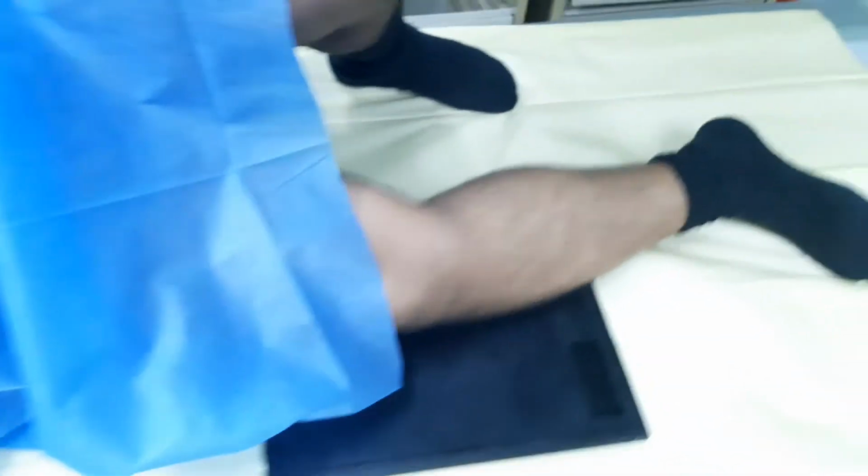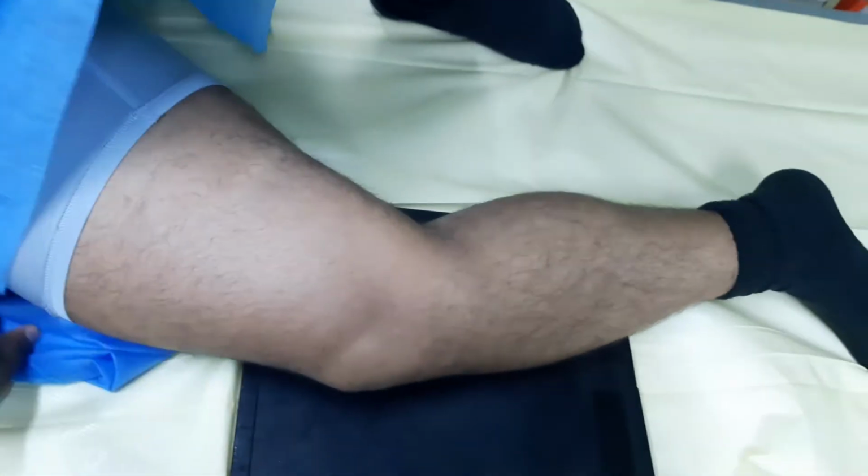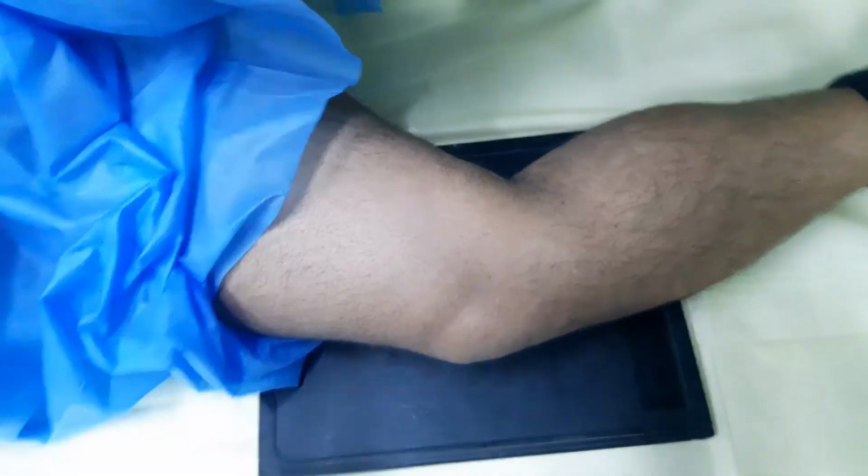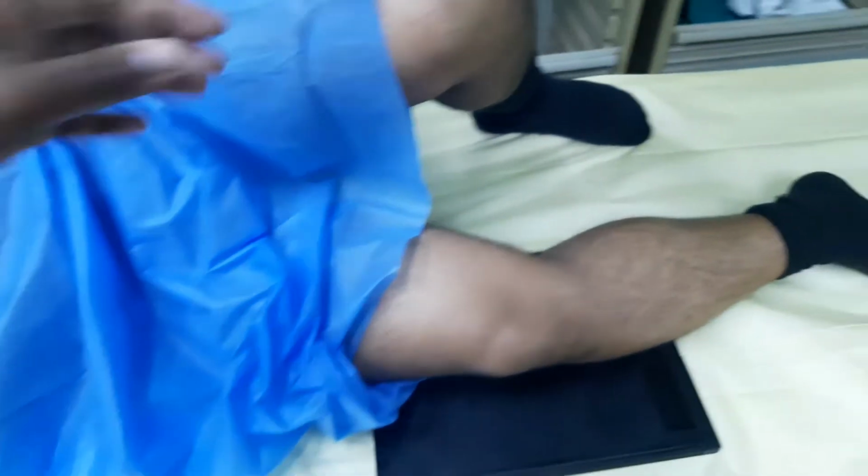Next, we're going to look at the lateral. So now we're going to have the patient turn for the lateral. So you're turning to me. Right, you can adjust, obviously, you change your cassette or whatnot, right? And, trying to flash the people down there. Right, so raise up the knee a little bit. Good, so that's just me generally placing the cassette where I think the joint would be, right?